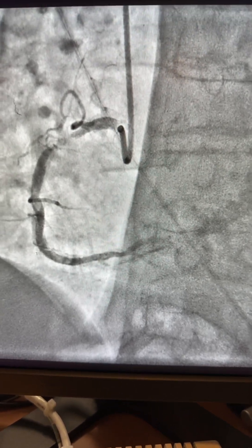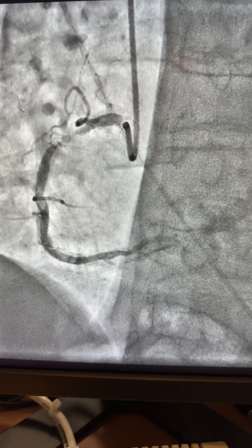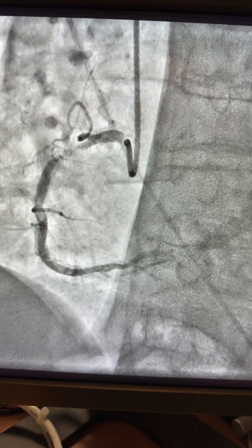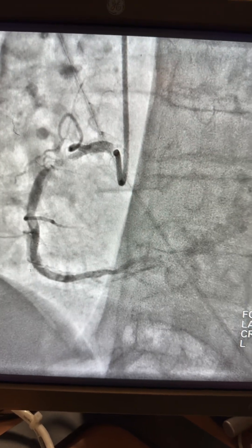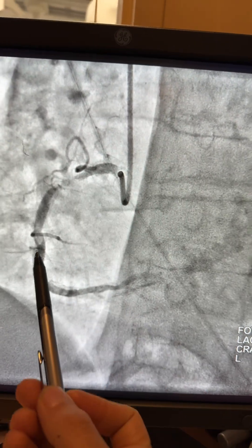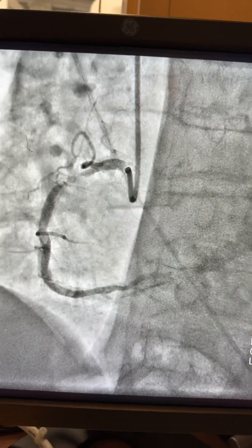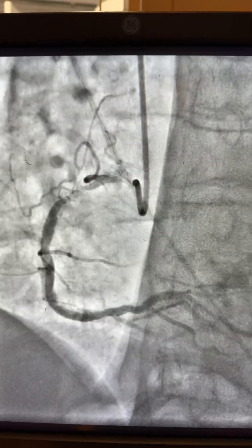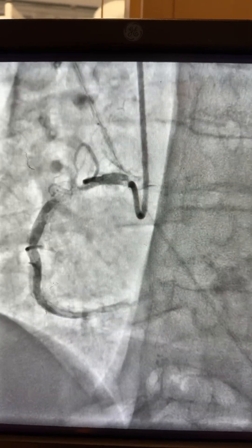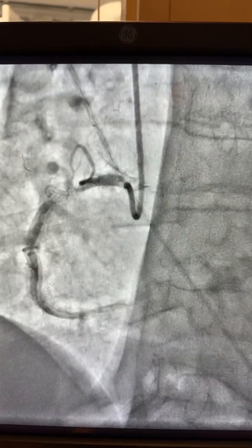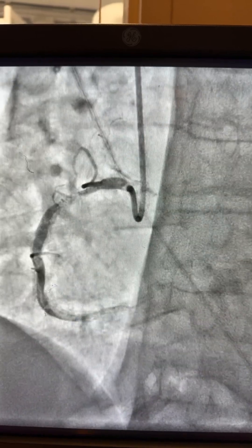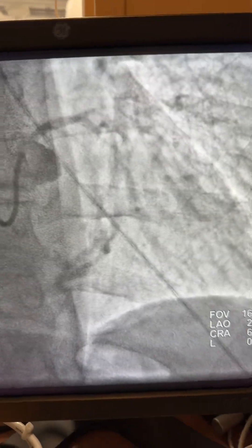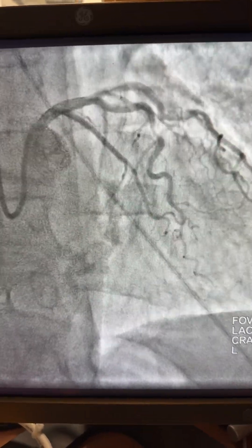Here is another case of lithotripsy or shock wave of a heavily calcified RCA. As you see here, it's a big chunk of calcium — actually 99% — but look at this eccentric lesion in the mid RCA. This is an abnormal stress test in a female, 70-year-old patient.